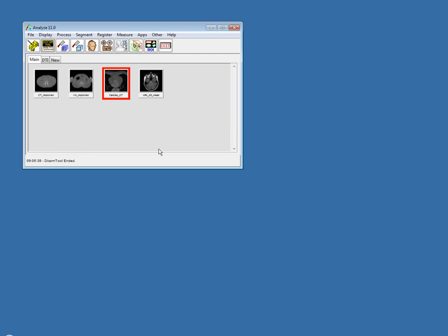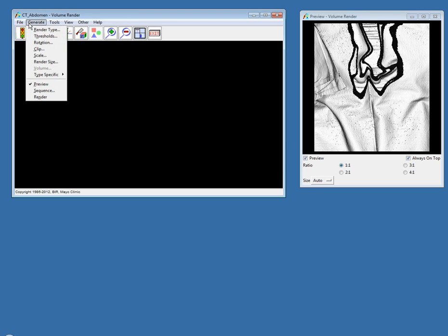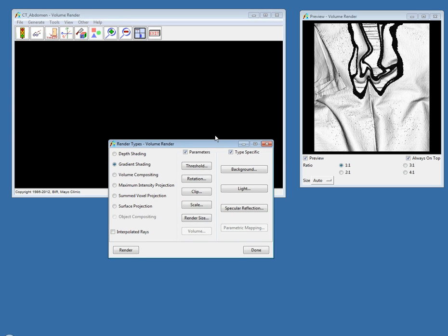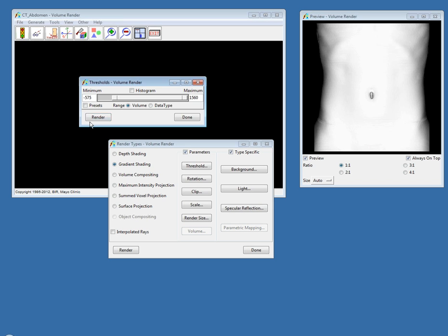I'm going to move into the Volume Render module and show you some of the new features there. I'll open Volume Render and the preview window. The first thing you'll notice in Analyze 11.0's Volume Render is the Render Type window, which now gives you immediate access to the other major rendering options underneath the Generate menu as well as the Render Type Specific options. If you click the Threshold button, the Threshold window will pop right up. I'll threshold down to the skin and hit Render.